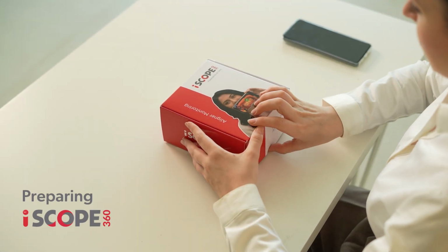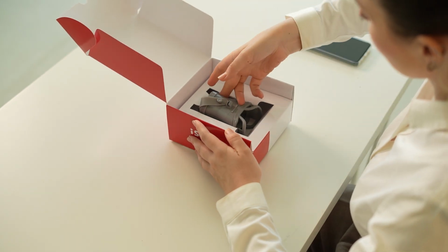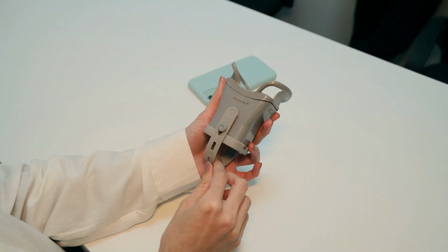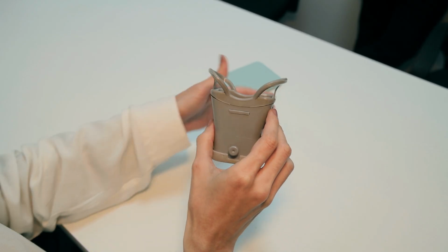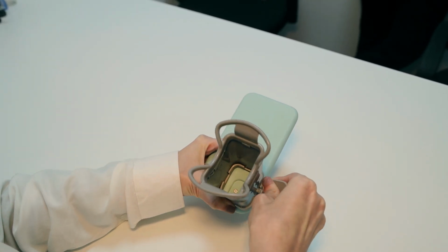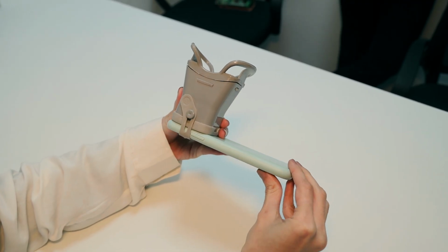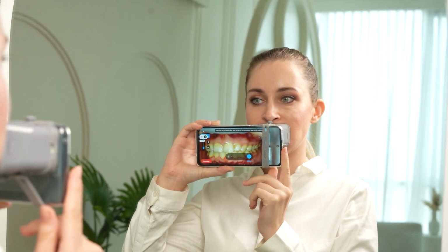Now we'll prepare the Scope360. Open the elastic straps on the Scope360. Now carefully strap it over your phone's rear camera. You have to ensure that the camera lens is at the center of Scope360. Any shift in this position will prevent you from capturing scans properly. Now the patient is ready to scan. Your teeth should be bright and perfectly centered on the screen.